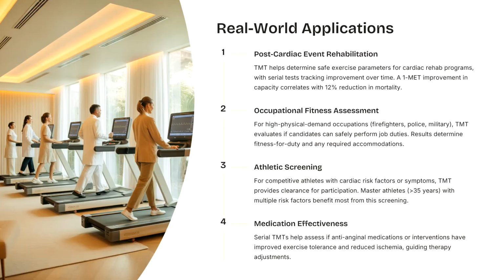Regarding the real world applications of TMT, it helps in post cardiac event rehabilitation. That means when a person has undergone the exercise test and has had any cardiac problem, then after that event, how the rehabilitation can be done, what will be the ideal rehabilitation procedure for that particular person. This can be predicted or suggested depending on the interpretation of the results of the TMT.